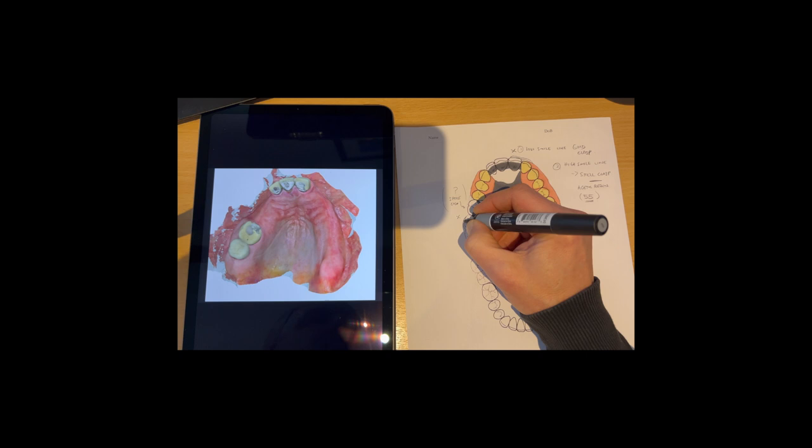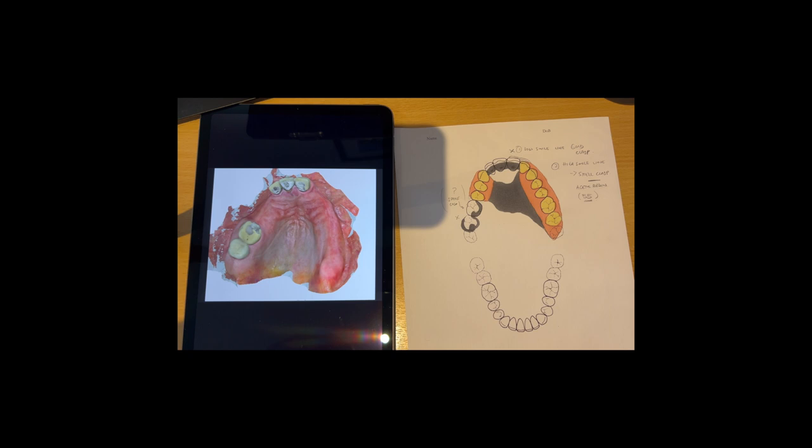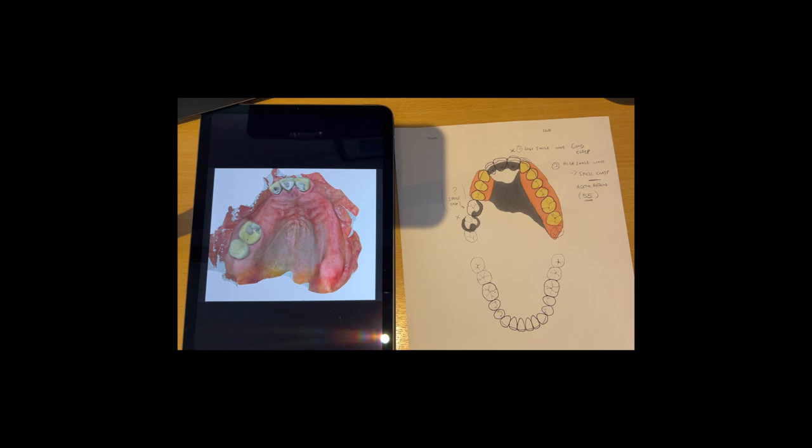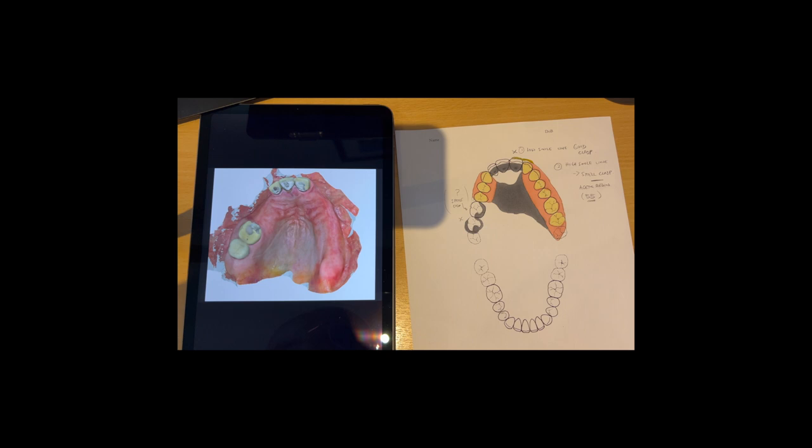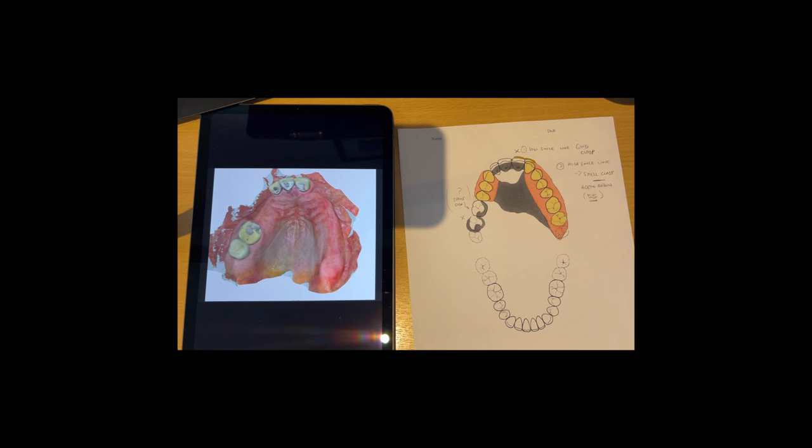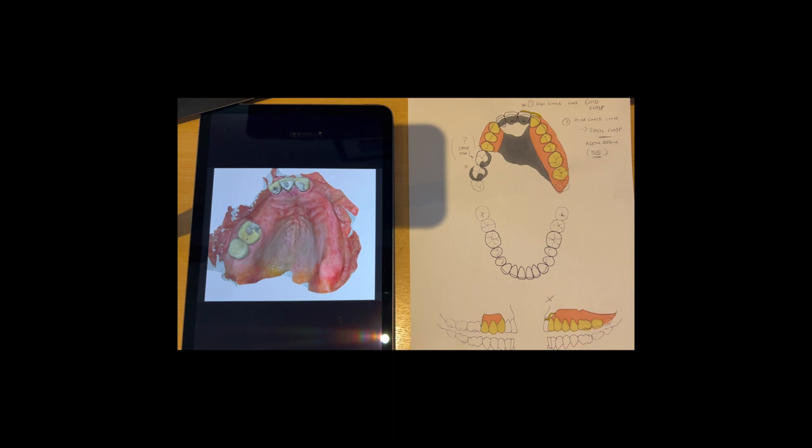So let's have a look at our clasp design. Here, low smile line, you could bring a clasp across here like this. That would be a gold clasp. I'm going to color that in. I've got a nice little gold pen here, a Pentel gold pen, to do that. It comes across there like that. The Xs on my drawings just mean we've got retention on those areas.